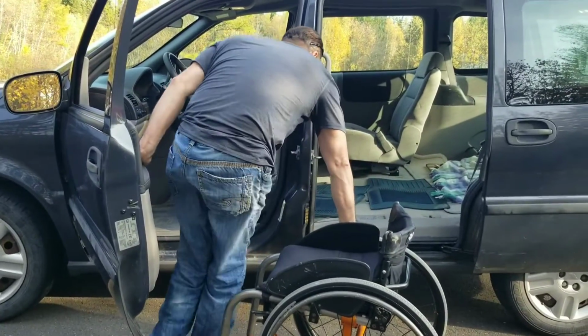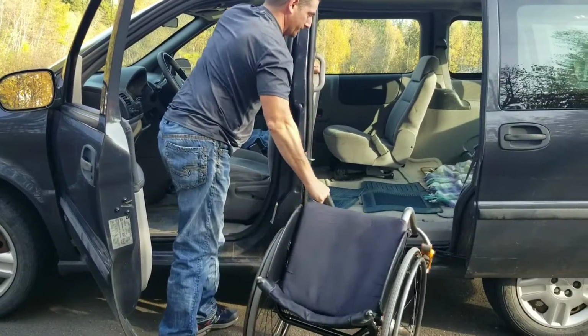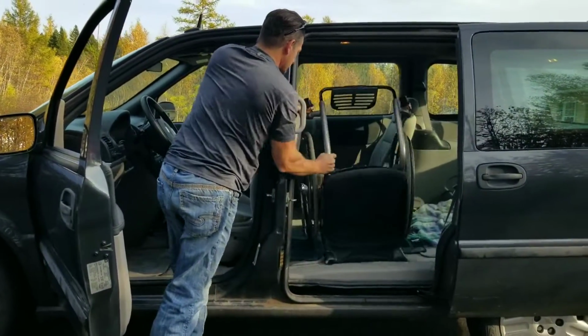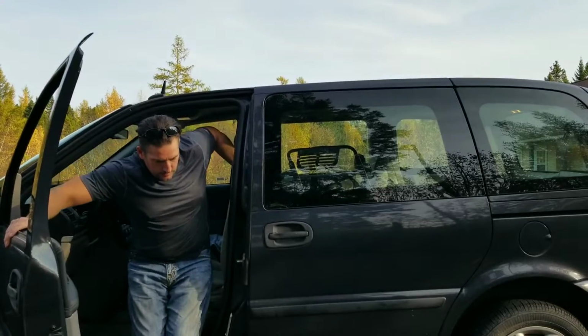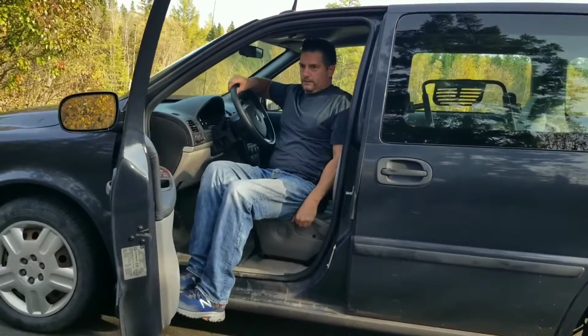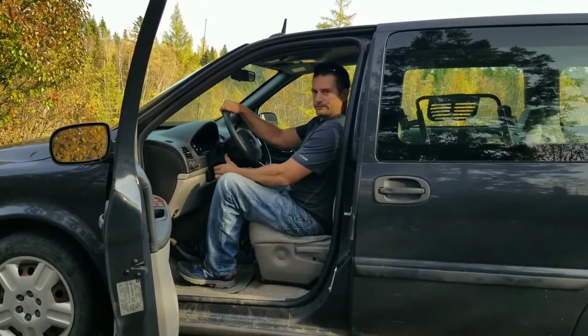Pop myself up. I didn't even put my brakes on. I'm so used to doing it. Set the chair like this. Door. I just kind of pivot, holding. Let myself down easy. I'm going to put the back a little bit there. There you go. Ready to go.